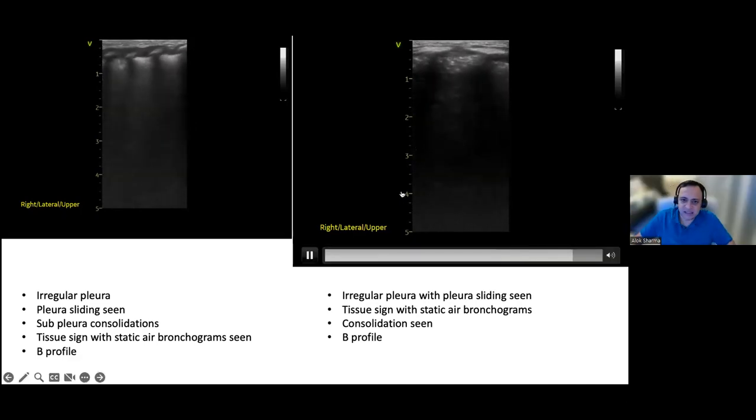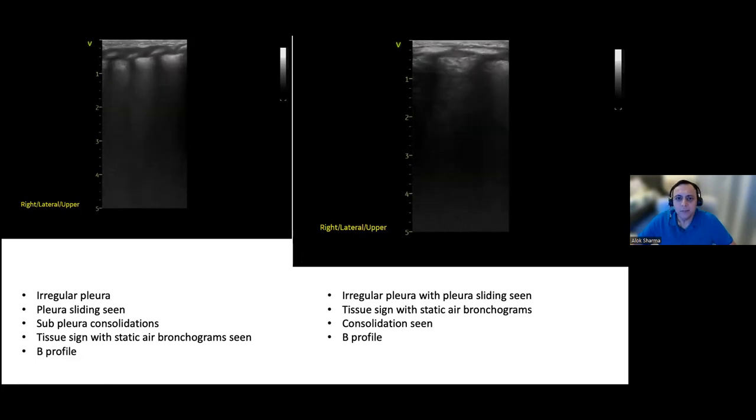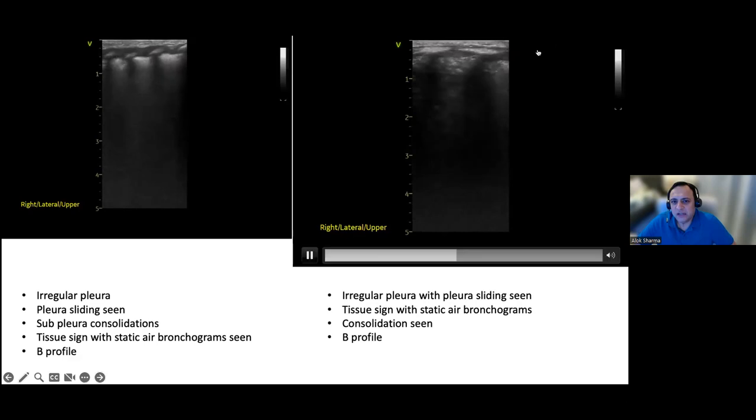I think so. What I'd say is, like I said, the pleura has to be irregular for a deep consolidation to extend all the way through. And what you're having at the moment is, you're using your hockey stick, right? Yeah. So you've probably got a little bit less gel here, which is why you're having an issue with contact in the deeper area. And the only other thought is, if you look at the rib margins here, the intercostal spaces, you've got them really well defined. Whereas over here, it's a little bit more difficult to delineate the bat sign. So I think you're probably getting a lot of bone, which is giving you a big acoustic shadow.